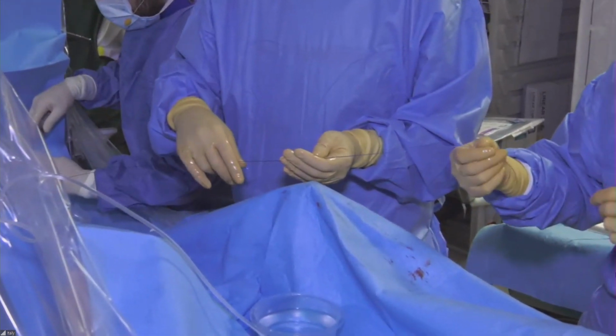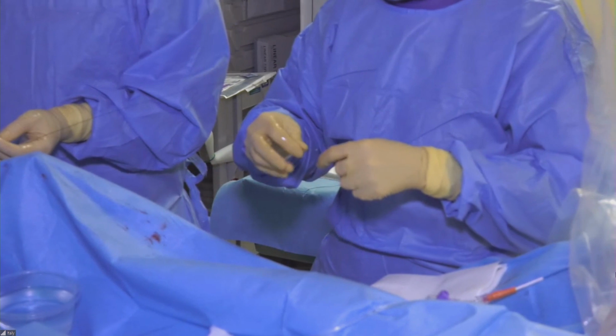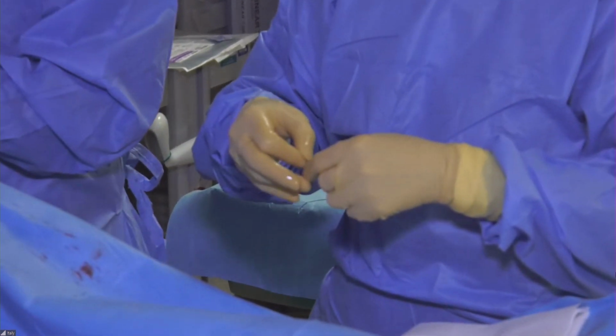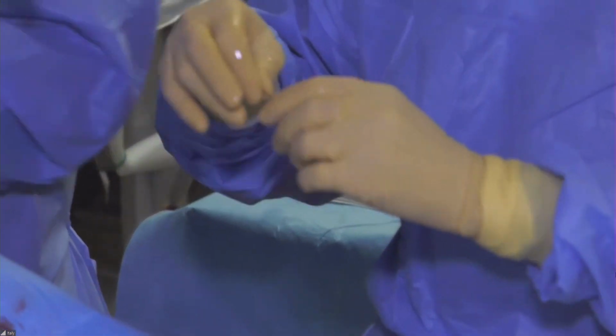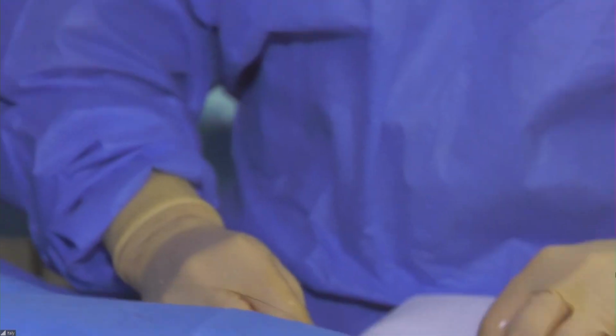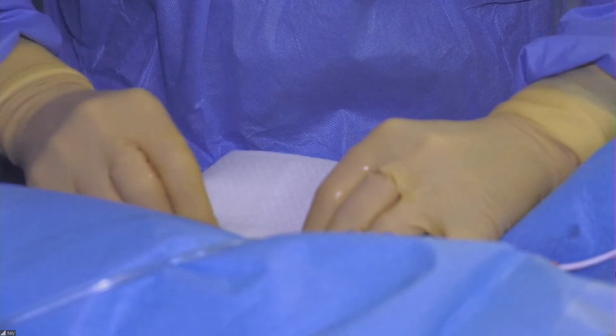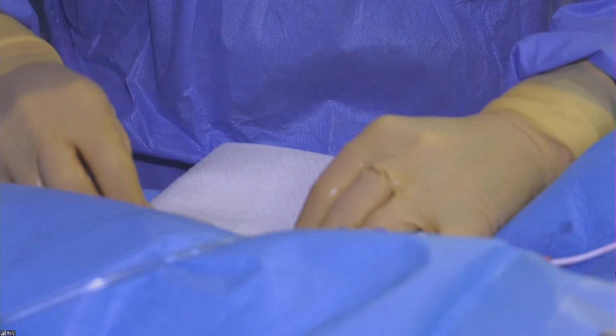So, as you know, I'm always more in favor of focal stenting, to treat where the lesion is and not to treat diffuse disease unless you really need to. ECG is fine, patient is stable.